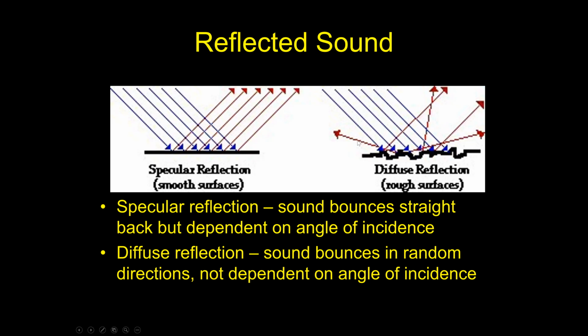The end result is that if we have a surface that's really roughened in appearance, we have much less sound that generates the picture. So the picture of that interface, in this case the capsule of the kidney, looks really ugly and kind of thick and not very well defined, because we don't have as much sound generating to form a picture.